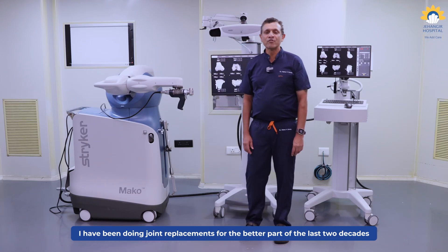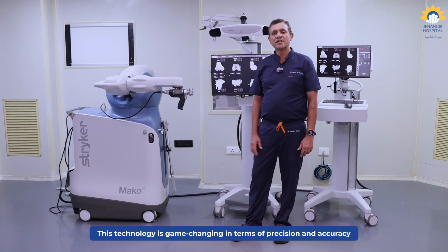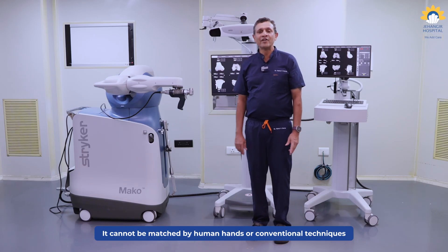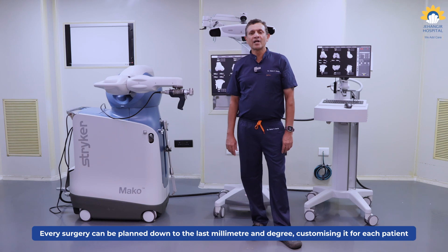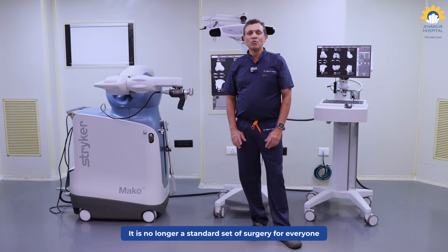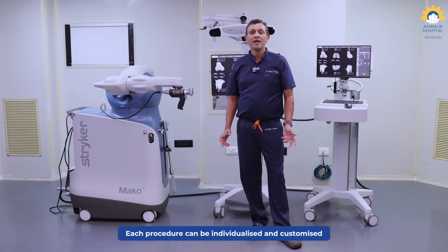I have been doing joint replacement for the better part of the last two decades. This technology is game changing in the sense that the precision and the accuracy is just unmatched. It cannot be matched by the human mind, hand, or what we have been doing by the conventional technique. Every surgery can be planned down to the last millimeter or degree, whereby customizing the surgery for each and every individual patient. So it's no more a standard set kind of surgery for everyone — it can be very much individualized and customized.